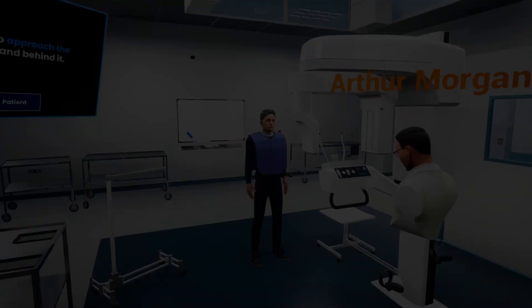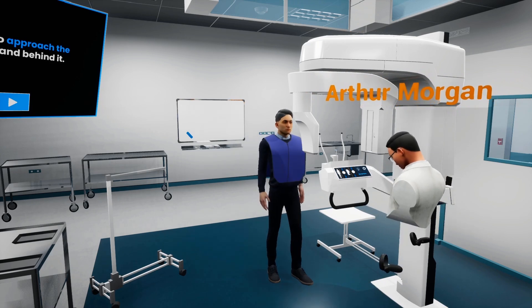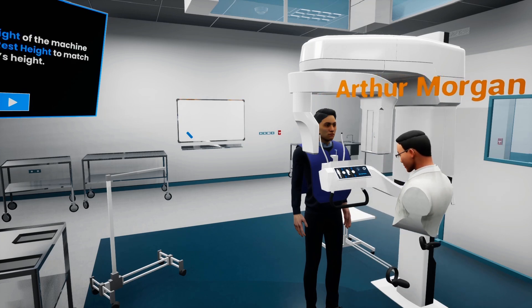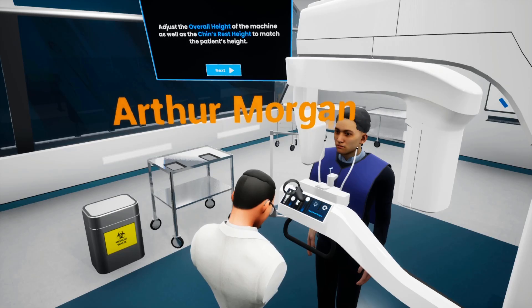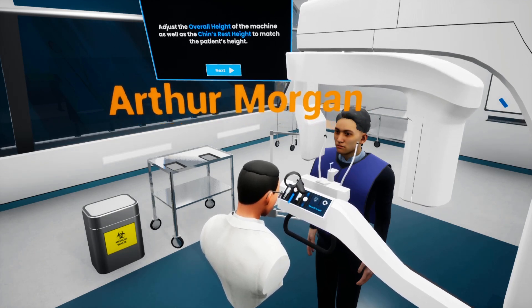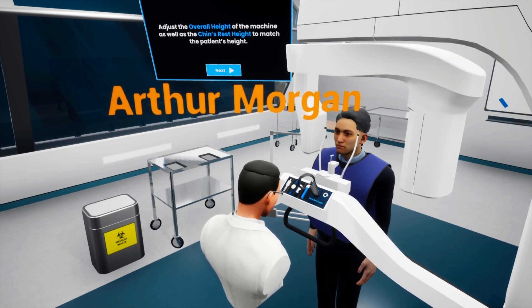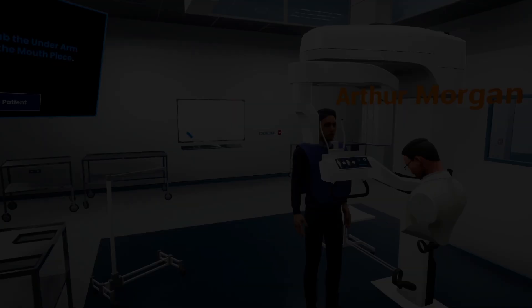Now that the patient is ready and the machine is set, we are going to ask the patient to approach the machine to get a better estimation of his height and then adjust the machine accordingly. There are two height controls on the machine. We begin by adjusting the overall height of the machine using the sliding button to the left. Once we reach a good position of the imaging plates near the head, we need to adjust the headrest component of the machine to match the patient's jaw's position by sliding the second controller up or down.